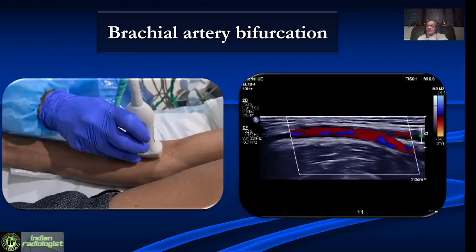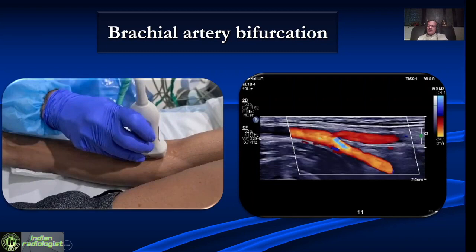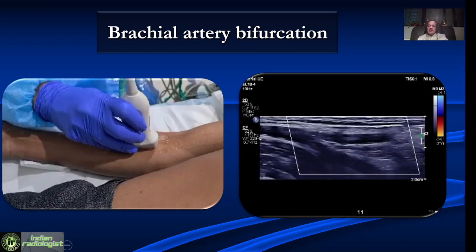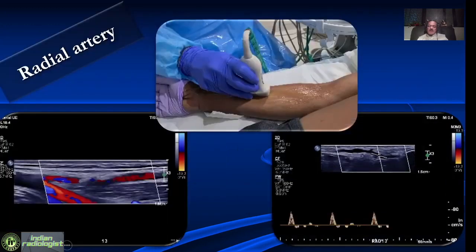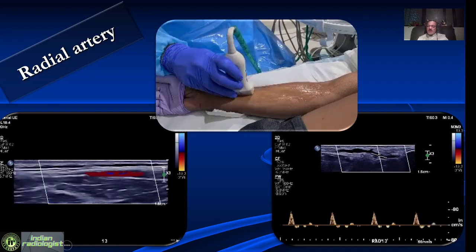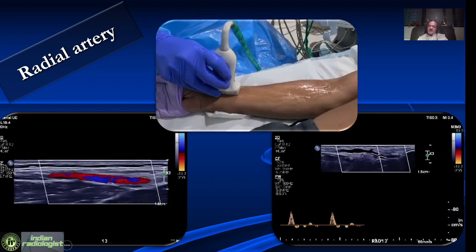It is very important to look at the brachial artery bifurcation — the radial artery going superficially and the other artery going down. We then trace the entire radial artery from its origin. It is easy to evaluate because it is superficial. As you go distally, we see a high resistance waveform. In elderly patients, we typically get a very high resistance waveform in the radial artery.